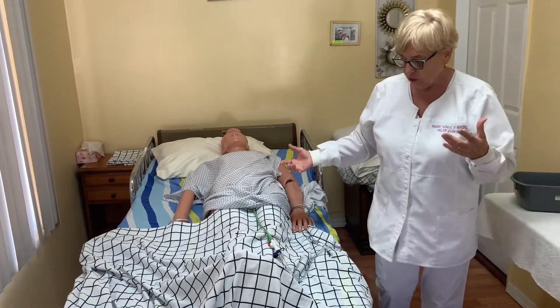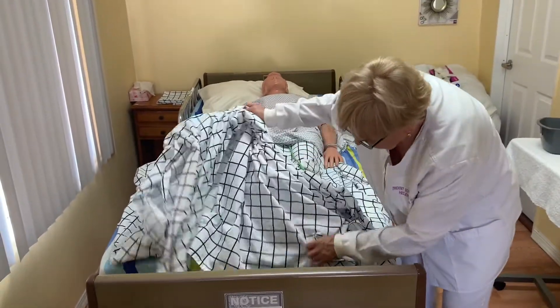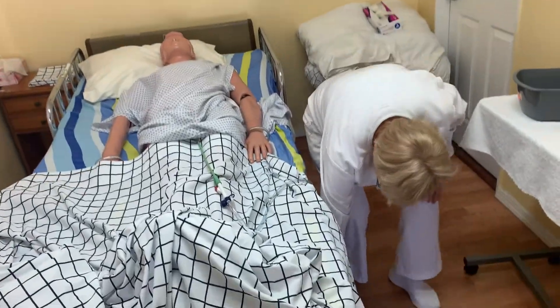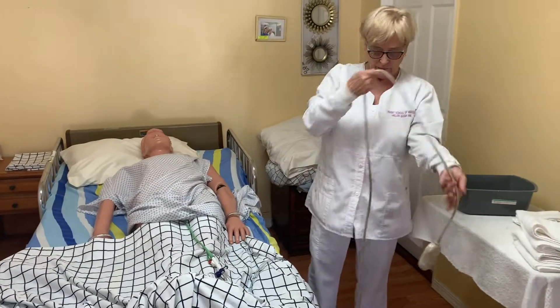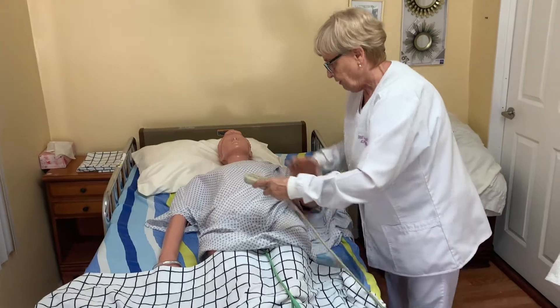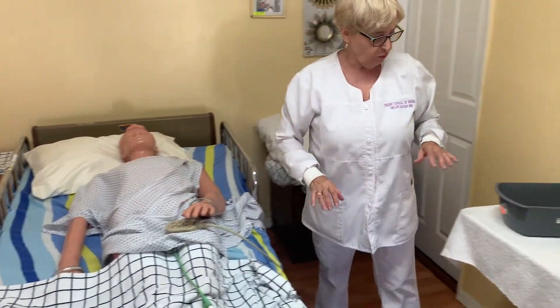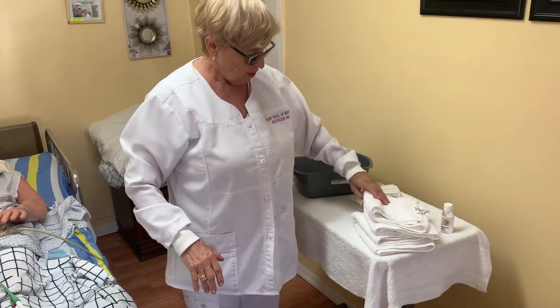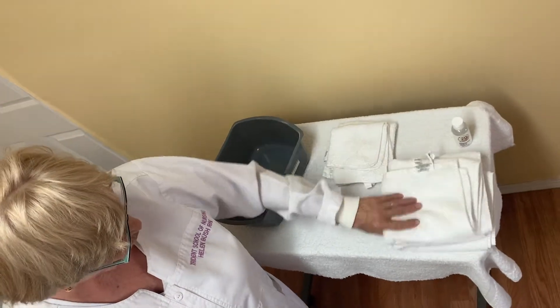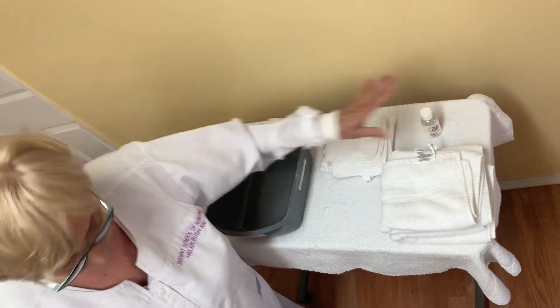Before I leave, here is the call light, just in case you need anything. All the time this call light should be within reach. I'm going to bring my supplies. My supplies will be two washcloths, two towels, a water basin, and soap. These are the supplies.